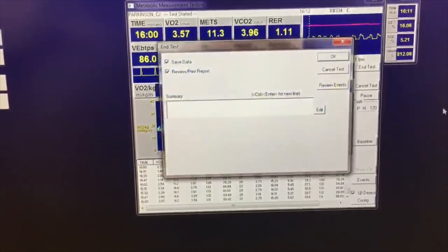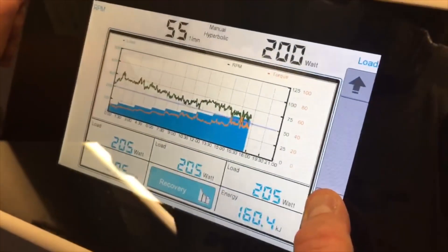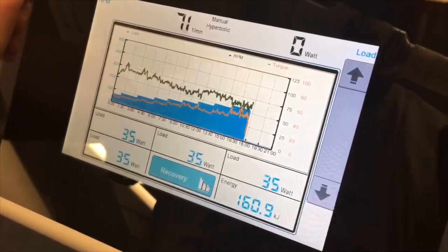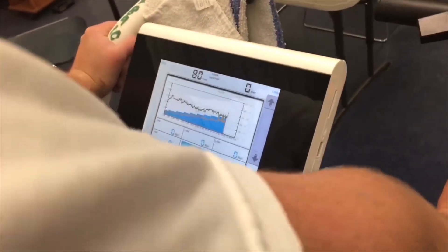We hit yes to end the test and let him take his watts down to zero to cool down. You never want to just stop the test — you always want them to cool down. He can do this for a couple of minutes. Normally, we'll look at the heart rate to cool down between 100 and 110 beats per minute.